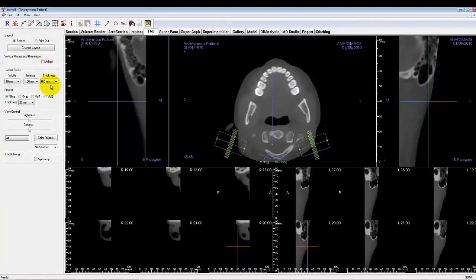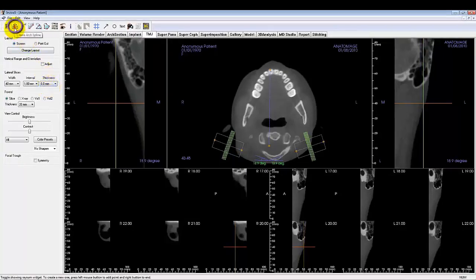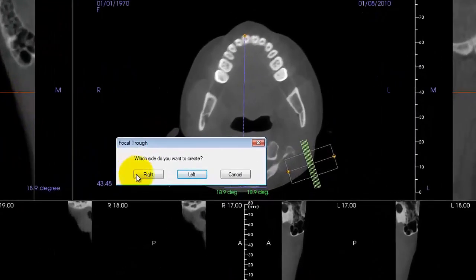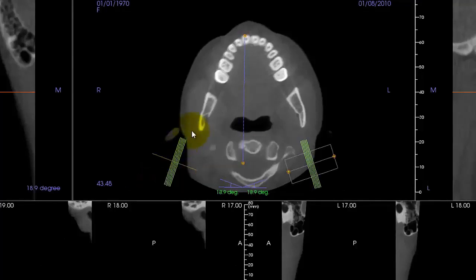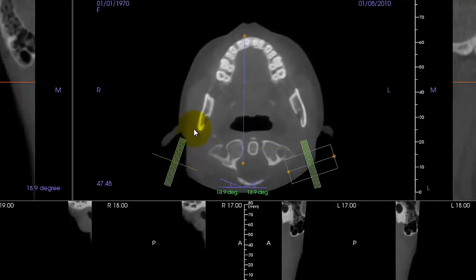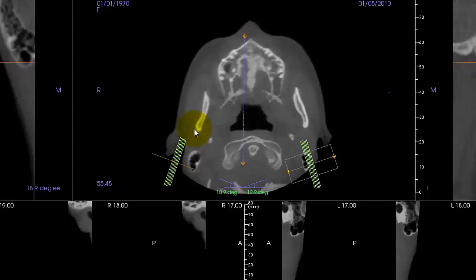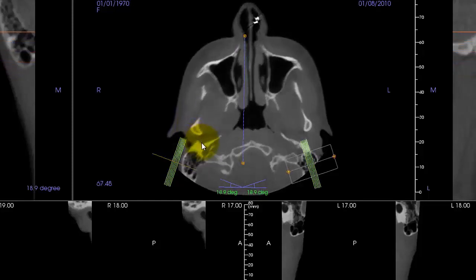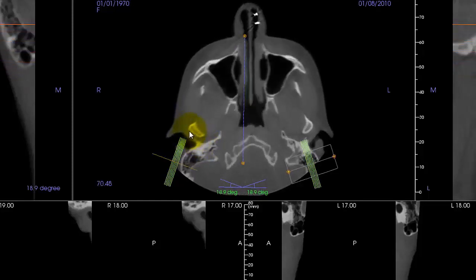Next we'll make the focal trough itself. Click on the Create Arch Spline button toward the top left on the toolbar. It will prompt you to create a focal trough on the patient's right or left. We will start with the right. We want to roughly put the focal trough over the patient's TMJ region. Use the mouse wheel to scroll through the slices until the condyle is visible and click two points across it laterally.